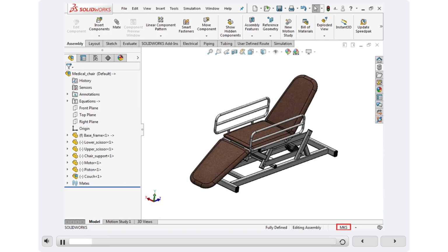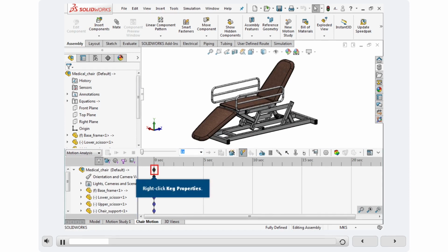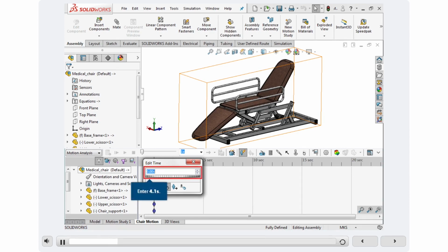Verify that the document unit is set to meters, kilograms, seconds. Create a new motion study entitled Chair Motion. Set the type of study to Motion Analysis. Next, we will set the simulation time. Right-click Key Properties. Click Edit Key Point Time. Set the simulation time to 4.1 seconds and click OK.